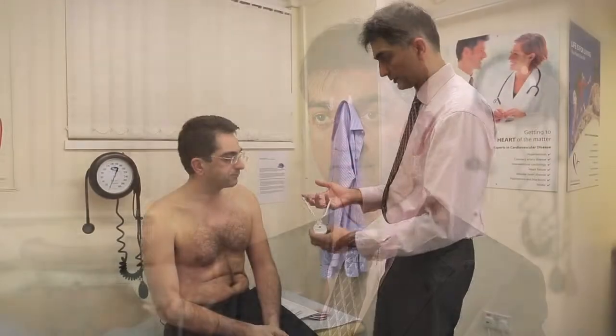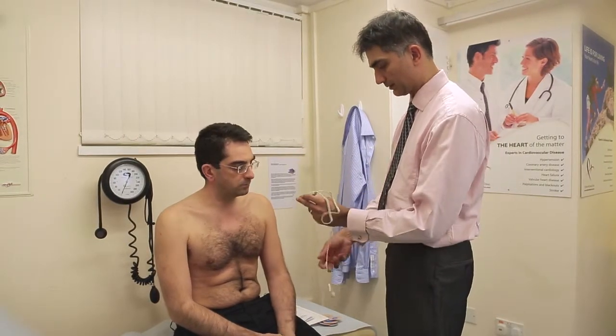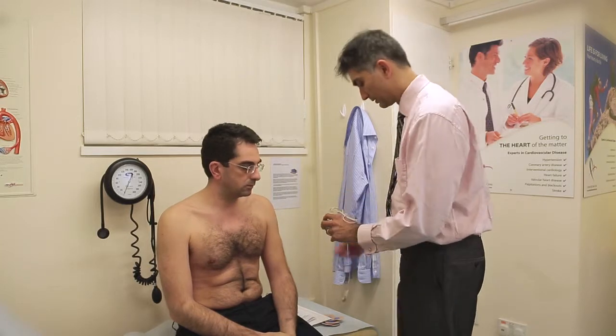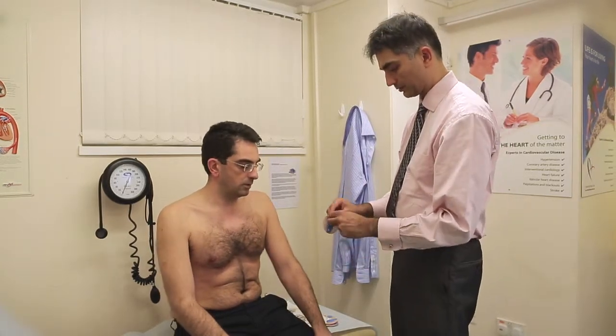An ambulatory ECG monitor is used for the diagnosis of palpitations or for the diagnosis of blackouts and dizzy spells. It's a small gadget that the patient wears under their clothes and it makes a continuous recording of the patient's ECG for the duration that the monitor is attached.